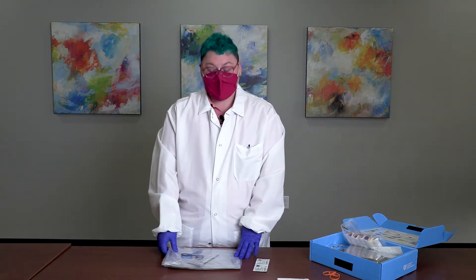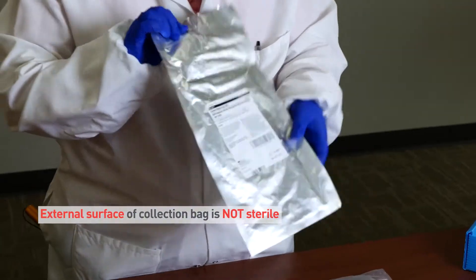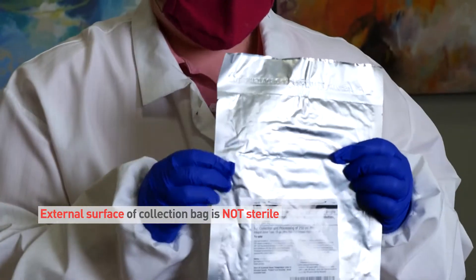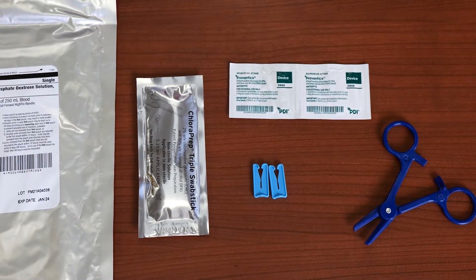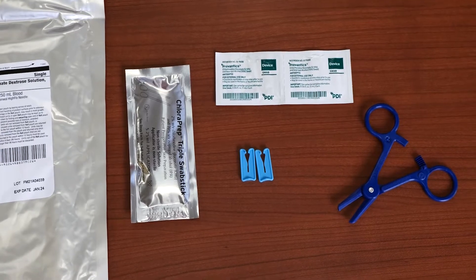When you're ready to do the cord blood collection, go ahead and open your supplies. These supplies include the Fresenius Kabi collection bag, which must only be used for vaginal deliveries. Additional supplies include a hemostat, two blue clamps, a chloroprep swab stick, and two chlorhexidine swabs.